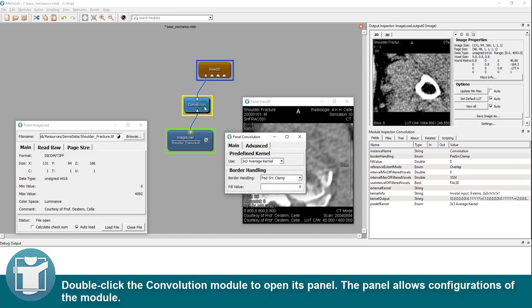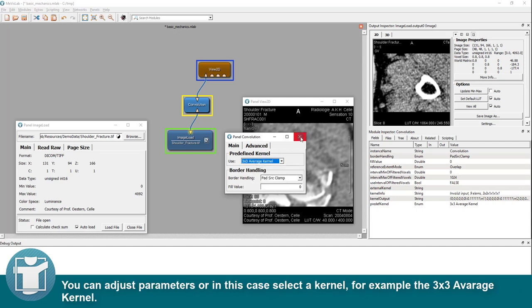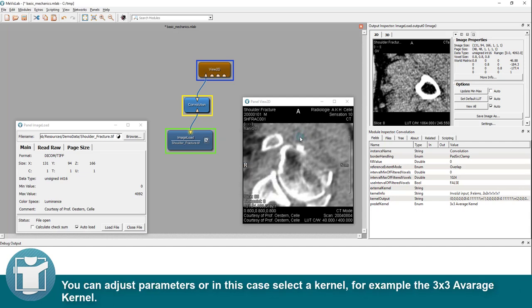Double-click the convolution module to open its panel. You can adjust parameters or in this case select a kernel, for example the 3x3 average kernel.